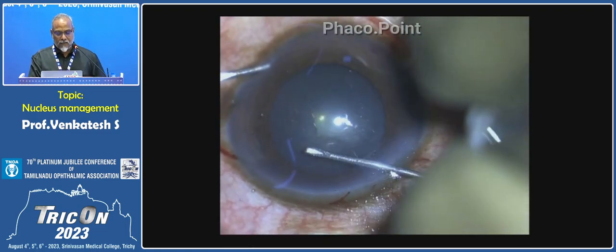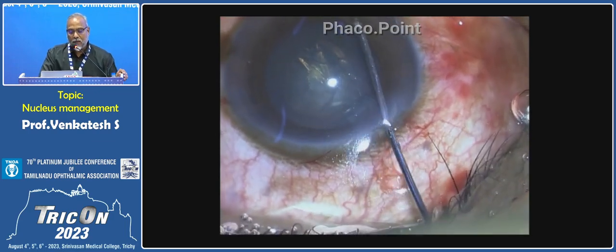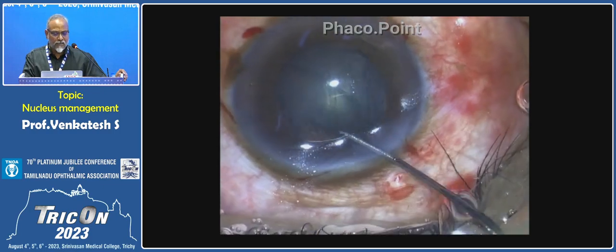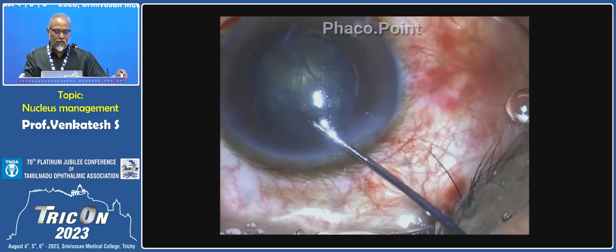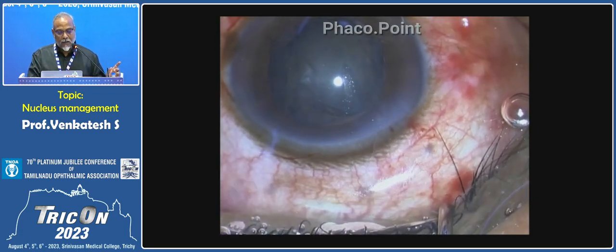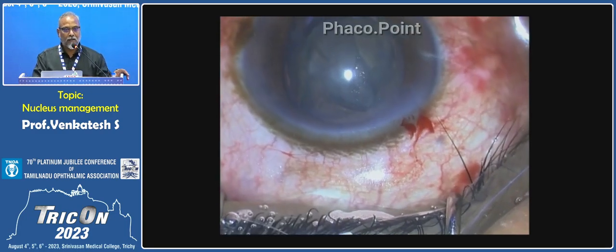So the safest and probably the easiest technique to do is hydroprolapse. In hydroprolapse, you have to create a large capsular rexis that is about 5.75 millimeters, and then use a hydrodissection cannula. You have to take it to the side and not across the lens. And then with the injection of fluid, the lens will hydroprolapse and it will lift up.